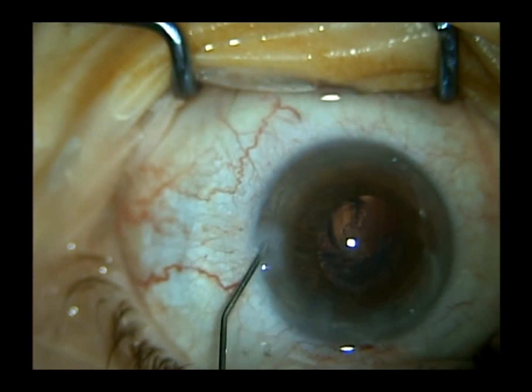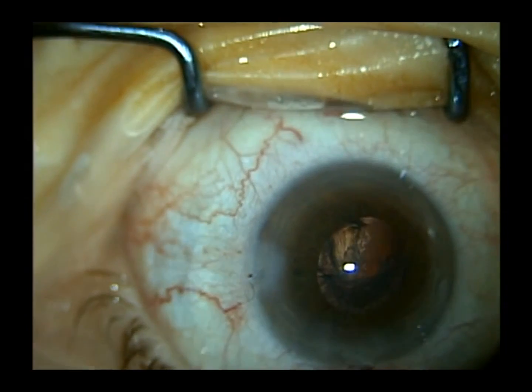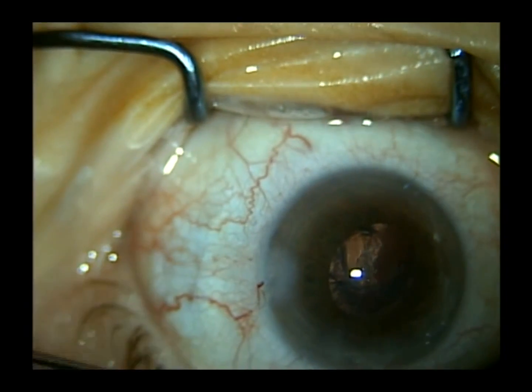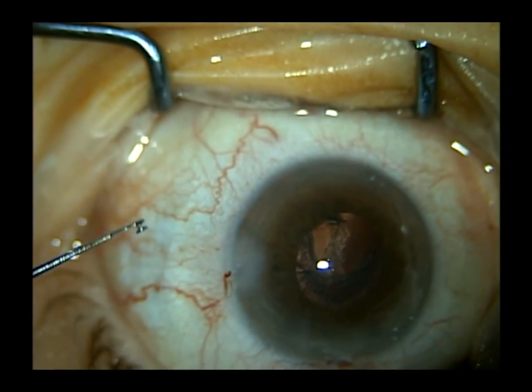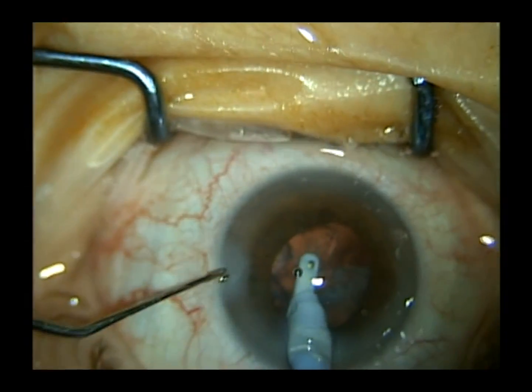Now that I'm pretty much finished with the phaco aspect of the case, I'll stromal hydrate my paracentesis incision to blow out any remaining fragments that may have become hidden near the paracentesis port.